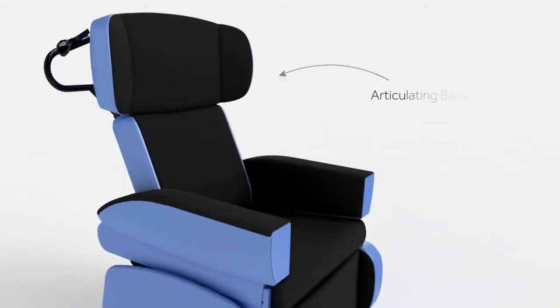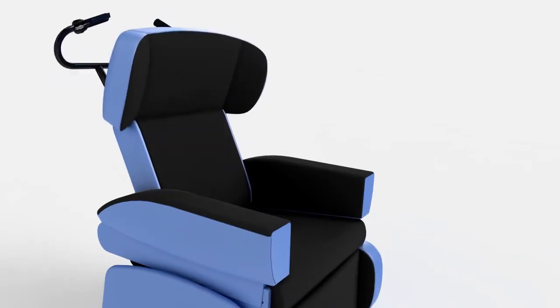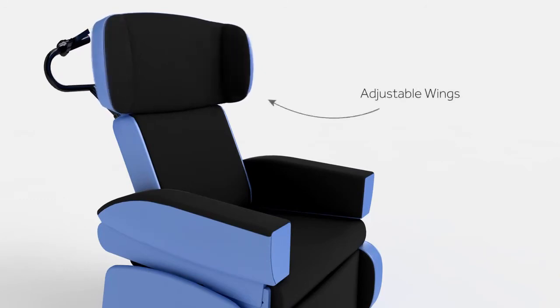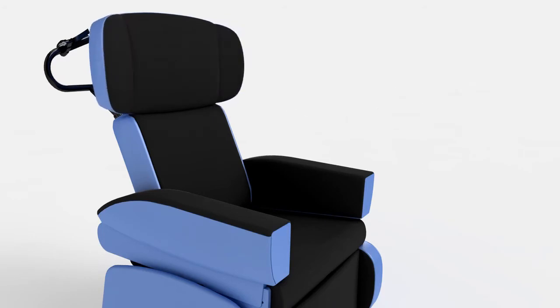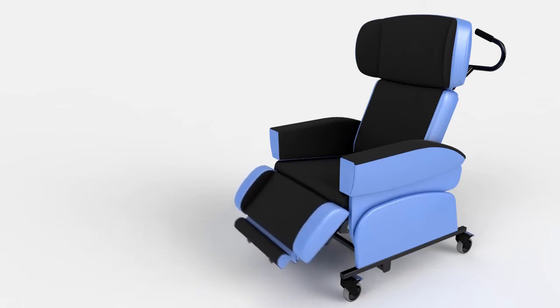The seat back allows for specific profiling to accommodate kyphosis and other complex head positioning issues. Combined with tailored adjustment of the wings — inwards or outwards — a stable head position can be achieved, ensuring maximum comfort for the user.